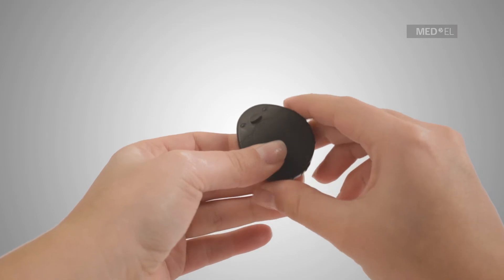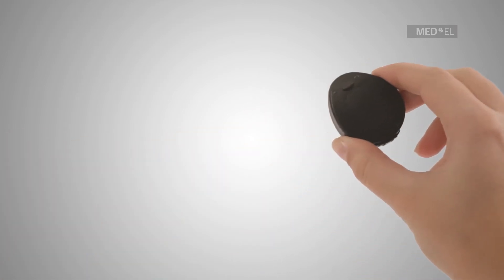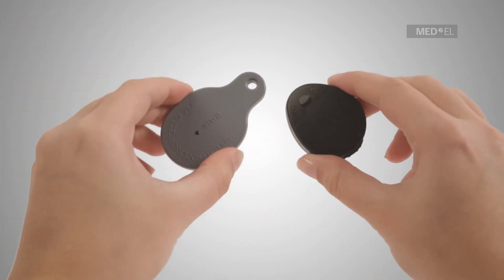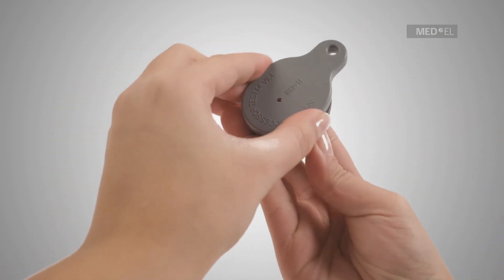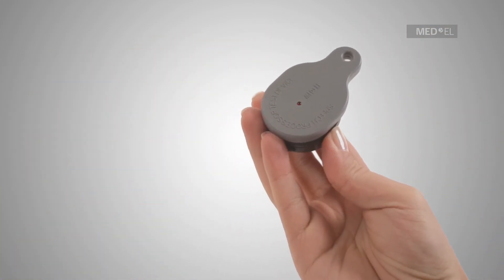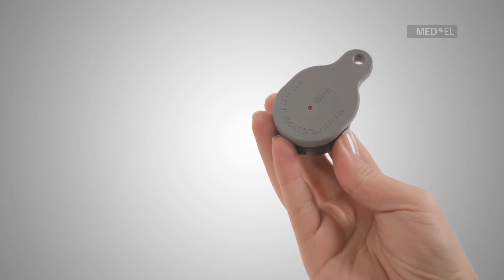After first switching it on, place the RONDO underneath the Speech Processor Test Device. The RONDO should be upside down and the red indicator light of the Speech Processor Test Device should be face up.